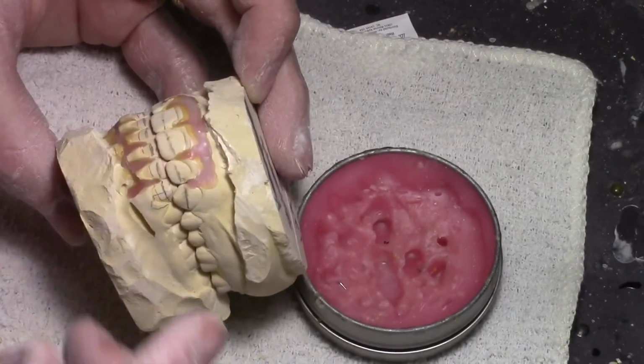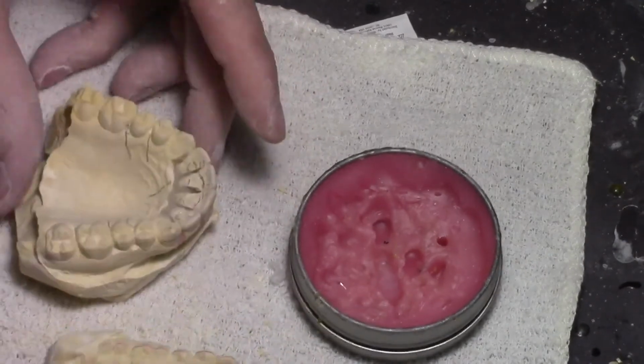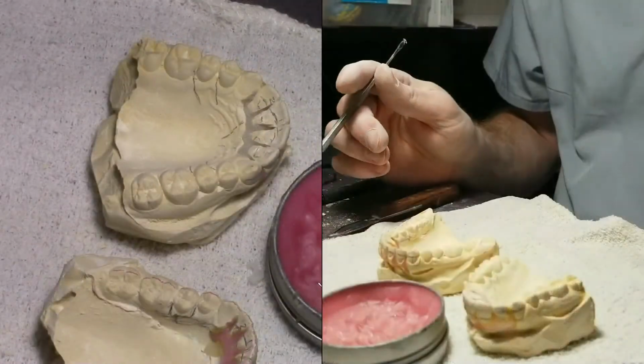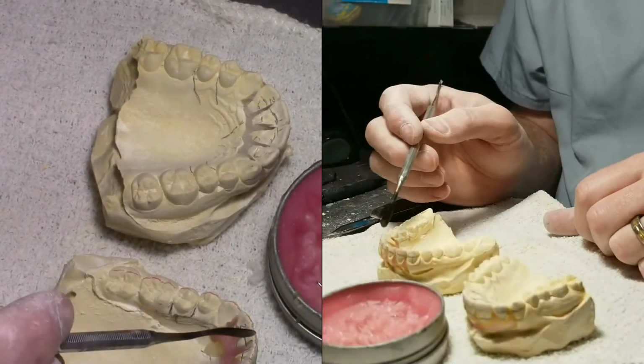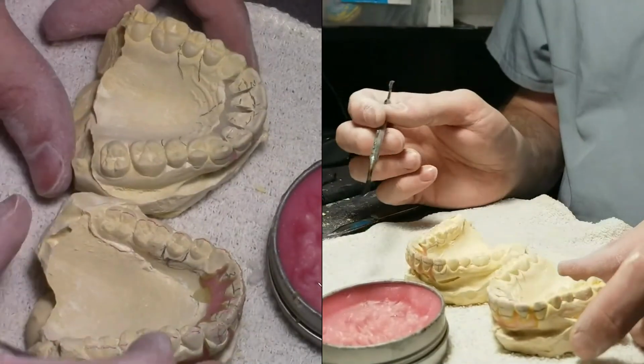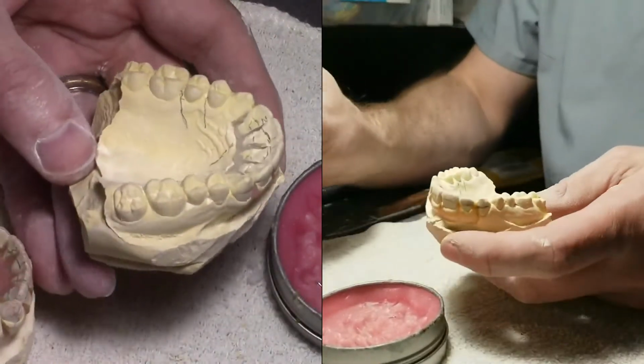This was a major open bite, and this was really flattened out. So it was very difficult. I didn't know how this was going to turn out. It turned out way better than I thought it was.